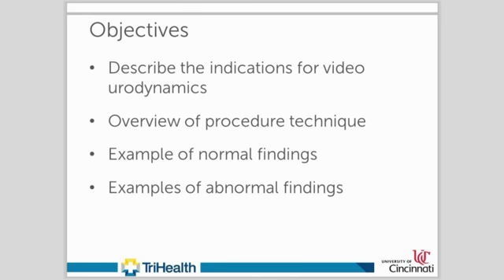The objectives of this video are to describe the indications for video urodynamics, provide an overview of the procedure technique, and to show examples of normal and abnormal study findings.